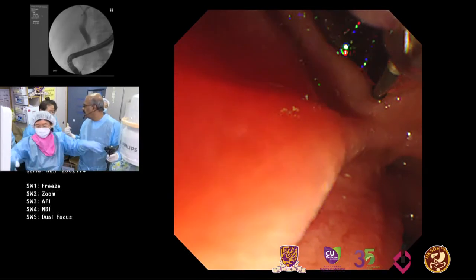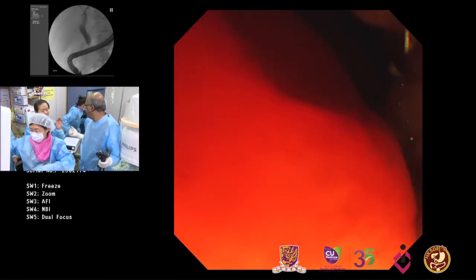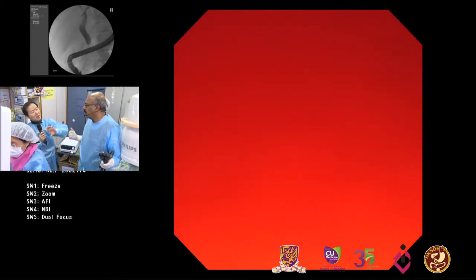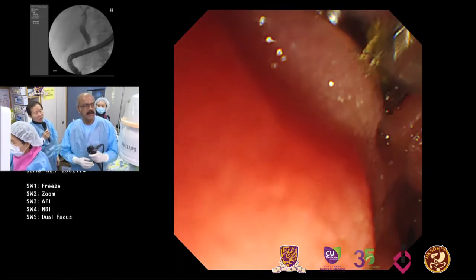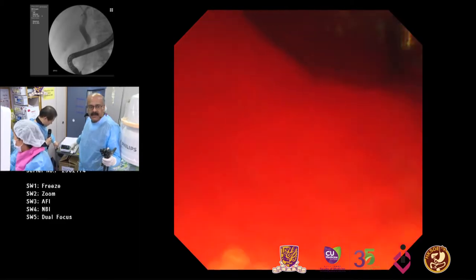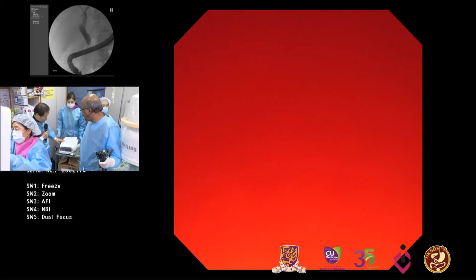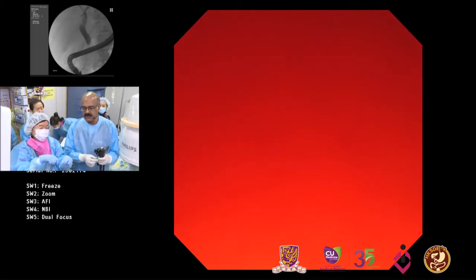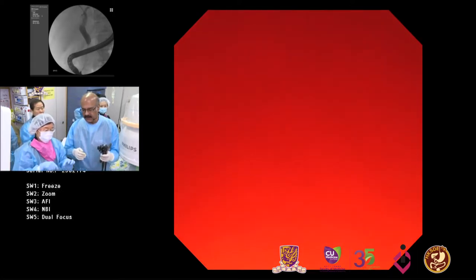Yeah. So I think what we can do is, after insertion of the electrode, we can recalculate the proximal and distal part. Because the electrode has a metal tip. We'll see how much it is covering. Yeah. So we also like the camera person to focus on the generator. This is very important. We'll come back to you because we might have to wait when you're doing this procedure as the 2 minutes time is on. So that's a lot of boring time on live endoscopy.